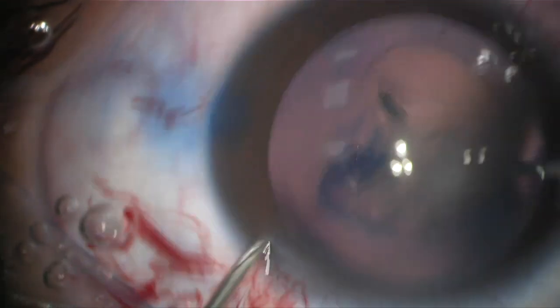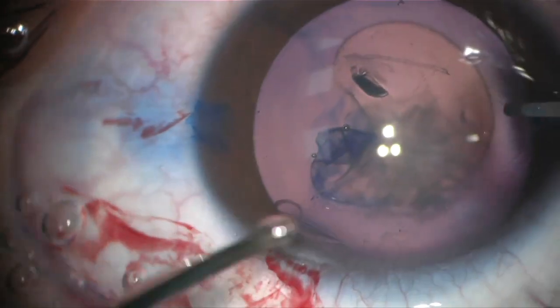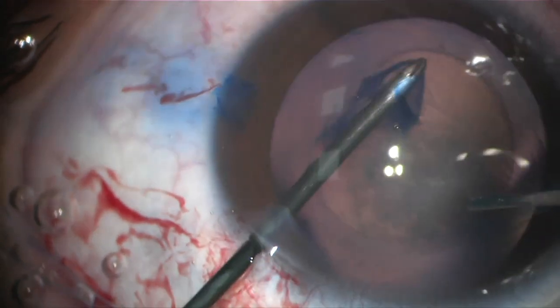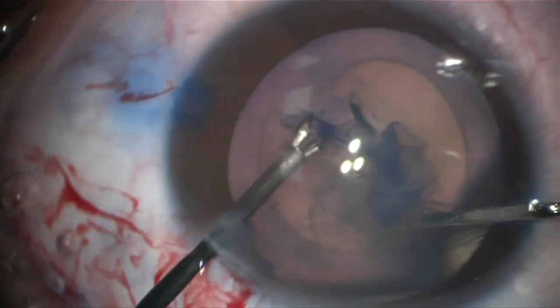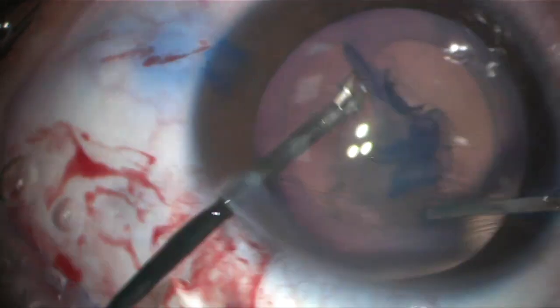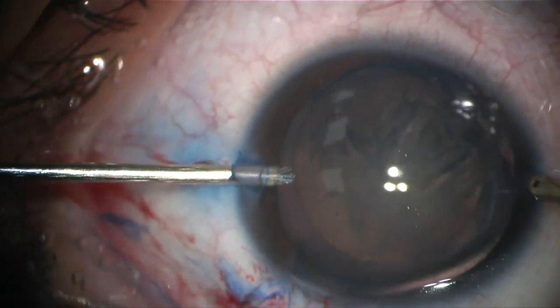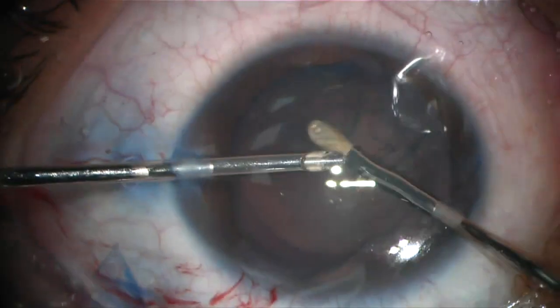It is preferable to continue with the micro-incisional capsulorhexis forceps to customize the size of the capsulorhexis. Straightforward hydrodissection and hydrodelineation are performed, while asking for the intraocular lens to be prepared and ready for implantation.